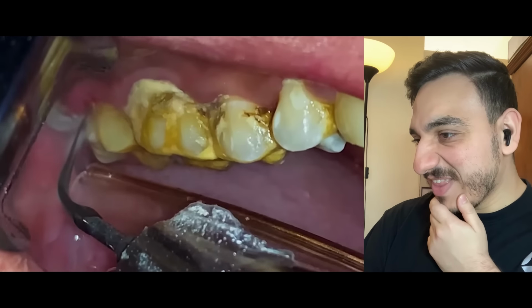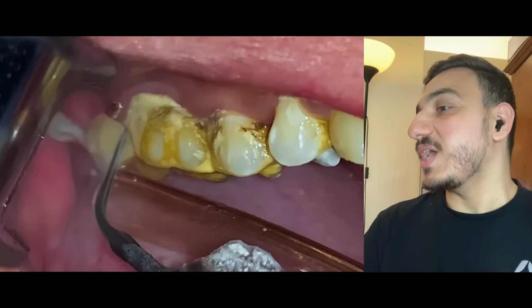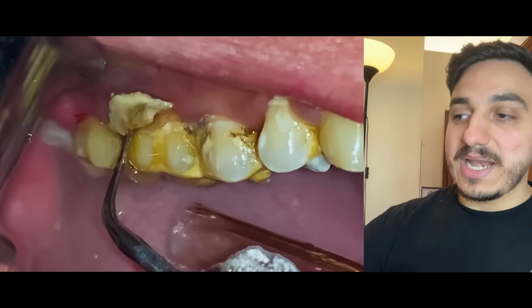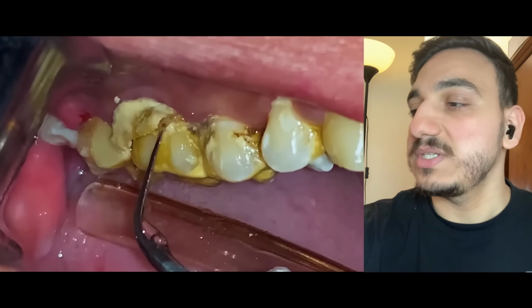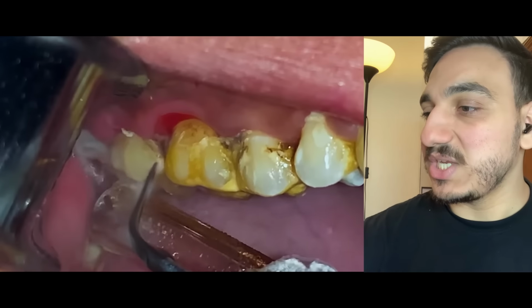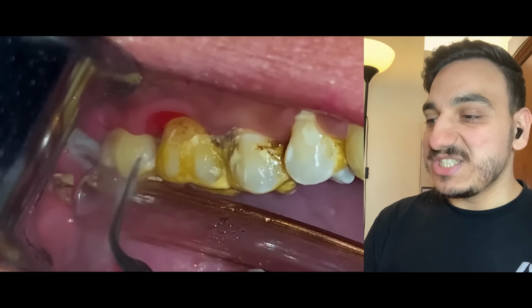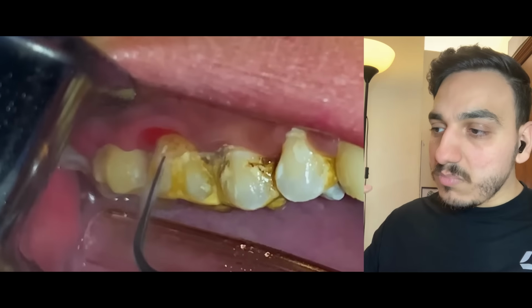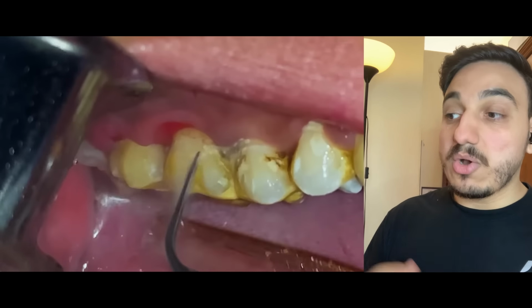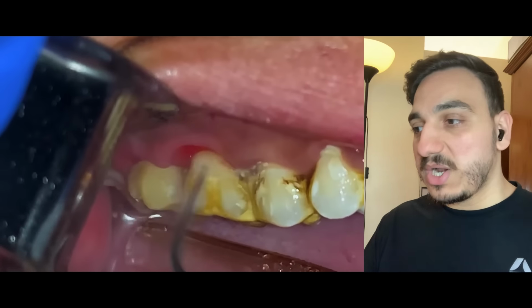Yo, that is a lot of dental calculus. I can tell you this, just an added fact: dental calculus can commonly occur on the surface of these upper molar teeth, and the reason is there's actually a salivary duct that opens very close to here. While saliva has a whole host of benefits, it also contains minerals. Fun fact, these minerals do help with remineralization.